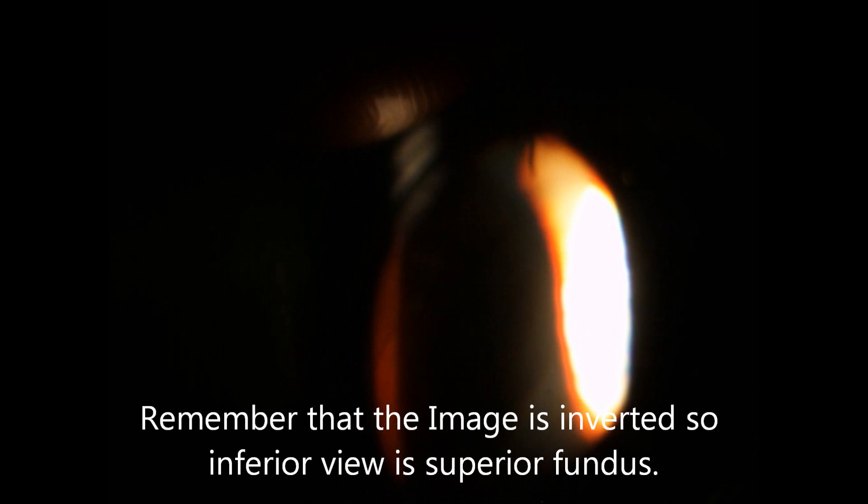Once the disc and the macula have been examined, you want to examine the peripheral areas of the fundus. You can ask the patient to look down, as you see here on the footage, and have a sweep across checking for even flat pigmentation and the absence of any lesions. This should be repeated in the other seven positions of gaze.